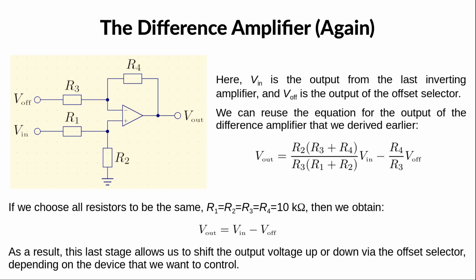If we opt for the offset selector, then we need a last difference amplifier. We can take the expression for the output potential that we found earlier. If we choose all resistors to be the same, then the output is simply the input minus the offset voltage. Since the offset voltage can be positive or negative, the output voltage can be shifted up or down.